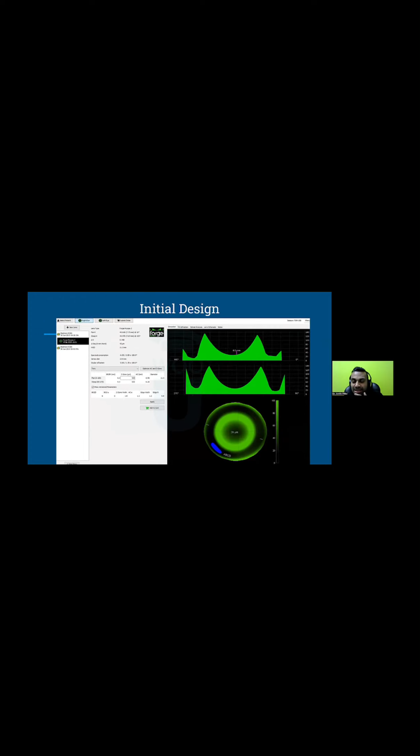All right. Again, here's the initial design. And this time I'll go further out. Same change, but in the alignment zone. So I'm still increasing the sagittal depth, but I'm just going further out. So we still see that increase of the apical clearance. We see some of that bleeding into the alignment zone. So again, not a proper fit. I would never make that change, but it's important to see how this software depicts those changes as you're making them.